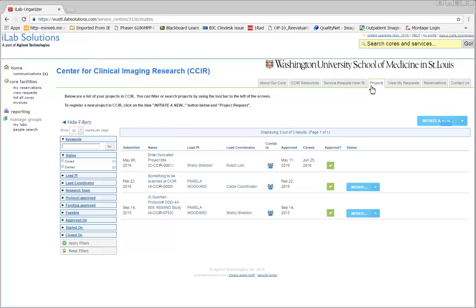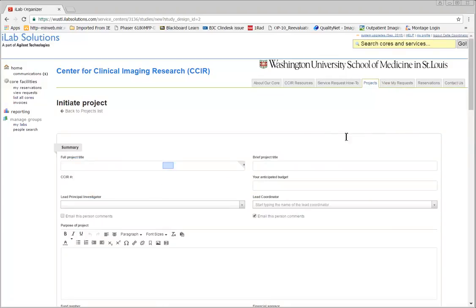Click on the blue Initiate a New Project Request button on the right. Fill in the project title, and under Brief Project Title, put the HARPO number.